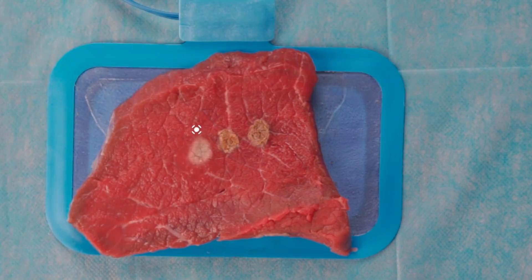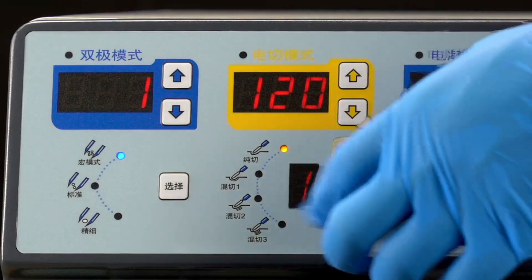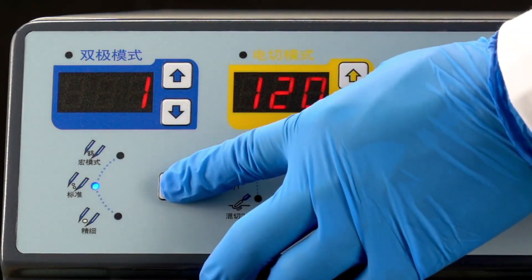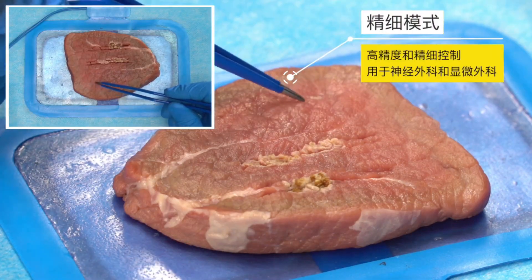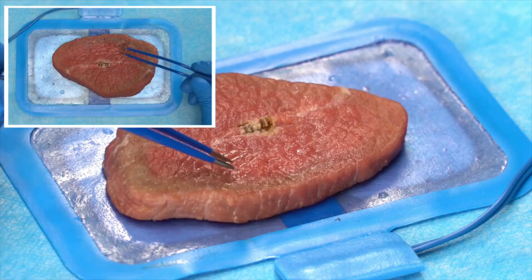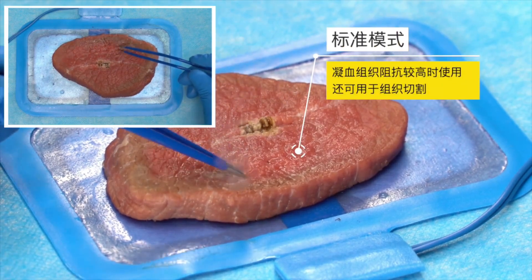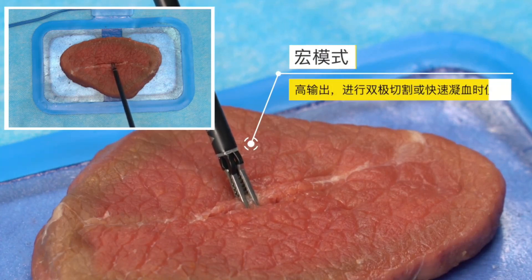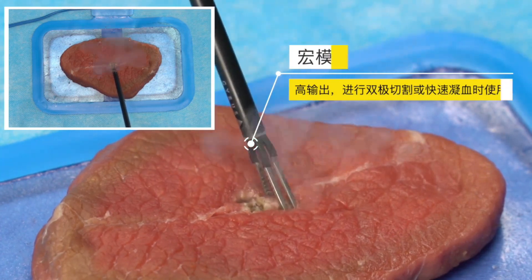In soft coagulation mode, the device can coagulate gently and penetrate deeply, effectively preventing carbonization of the tissue. In bipolar mode, the S300D electrosurgical unit has three modes: standard, precise, and macro. We push the button to switch the bipolar mode and set the power. Precise mode is used for high precision and fine control of the amount of drying, used in neurosurgery and microsurgery. Standard mode is suitable for most bipolar applications when the impedance of coagulated tissue is high, and can also be used for tissue cutting. Macro mode is used for bipolar cutting or rapid coagulation, which can quickly start energy and output a higher voltage power supply.